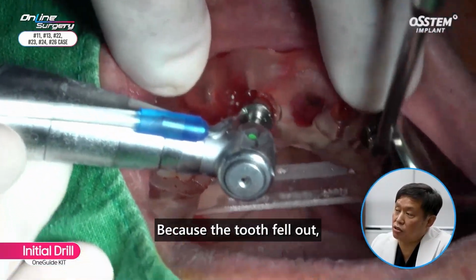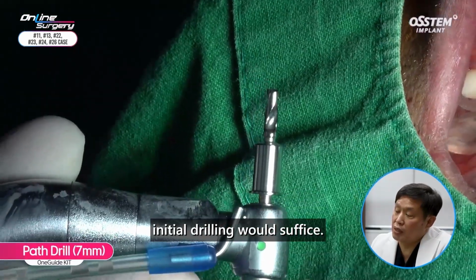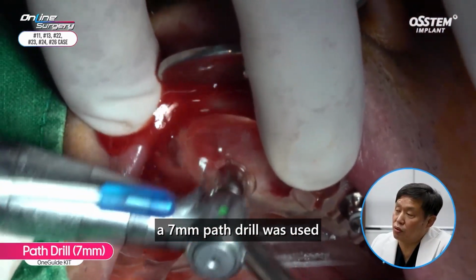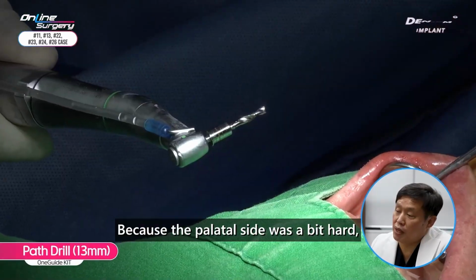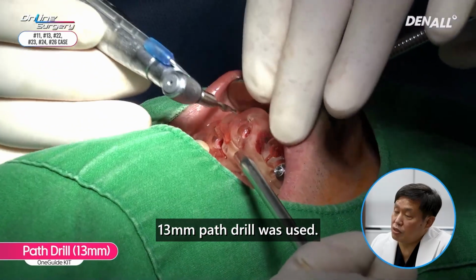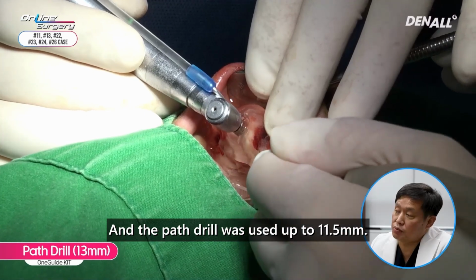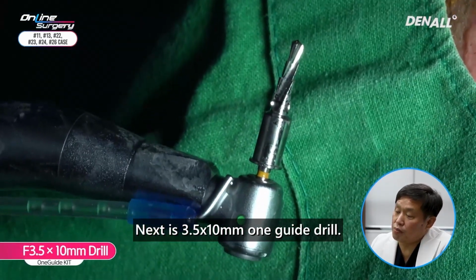Because the tooth fell out, I think initial drilling would suffice. In order to prevent any deviation on the palatal side, a 7 mm path drill was used to prevent any slipping. Because the palatal side was a bit hard, a 13 mm path drill was used. The plan was to place a 10 mm implant, and the path drill was used up to 11.5 mm. Next is 3.5 by 10 mm OneGuide drill.